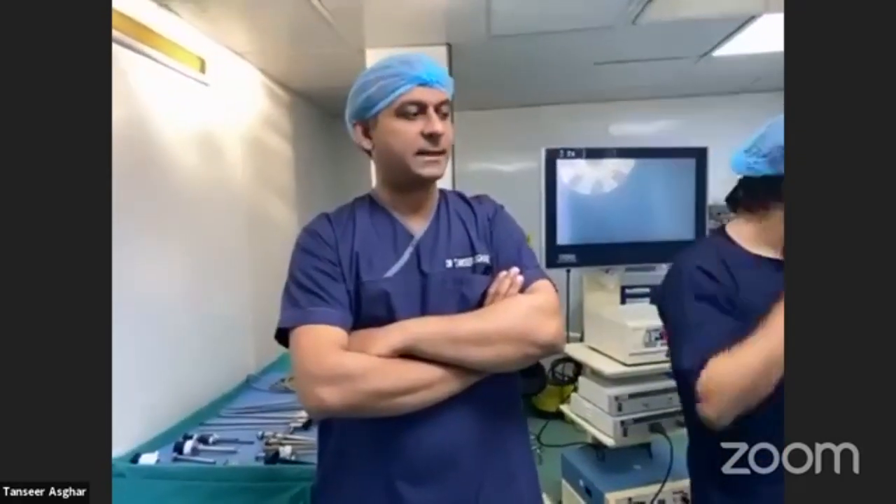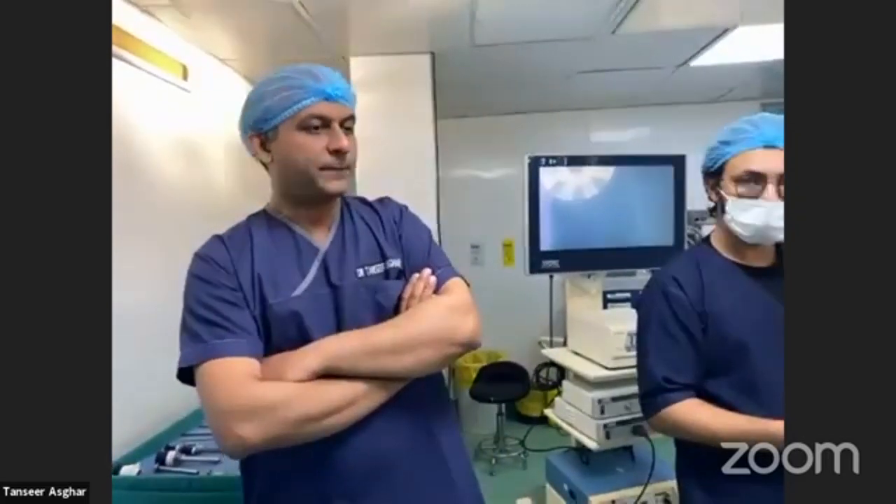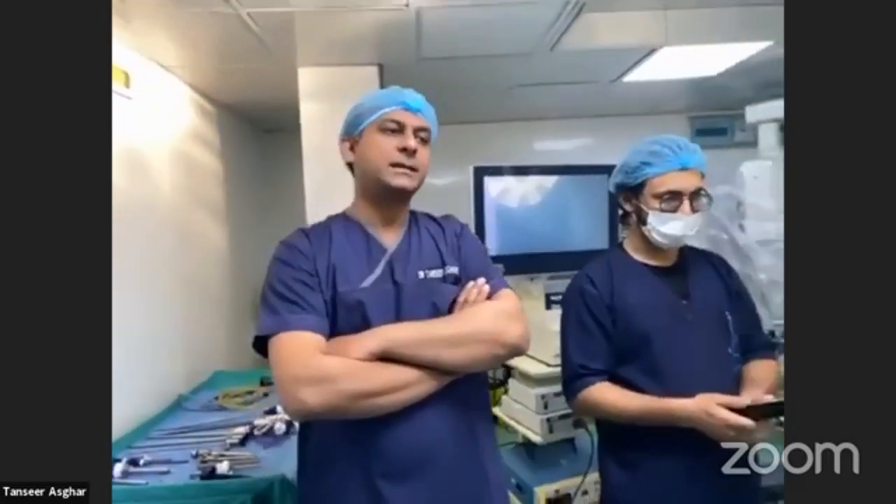I thought it better to show the instruments live and discuss them interactively so that people can see the instruments in detail. So now we will be moving towards patient positioning in laparoscopic surgery.